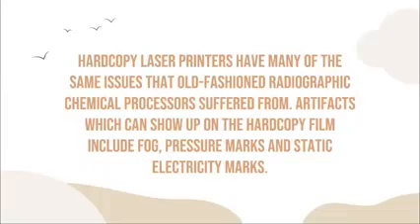Okay? So hard copy laser printers have many of the same issues that old-fashioned radiographic chemical processors suffered from. Artifacts which can show up on the hard copy film include fog, pressure marks, and static electricity marks. Okay? So same lang sa previous sa mga automatic processor, it can produce fog sa image, pressure marks such as ink marks, and of course static electricity marks. Okay, pag too much na ang humidity sa area, pag baba na kayo ang humidity sa area.